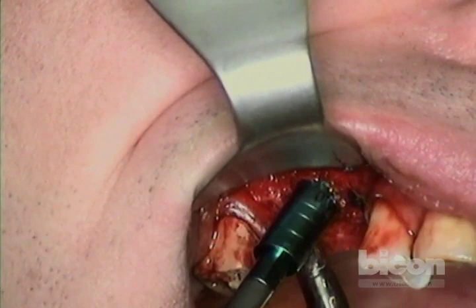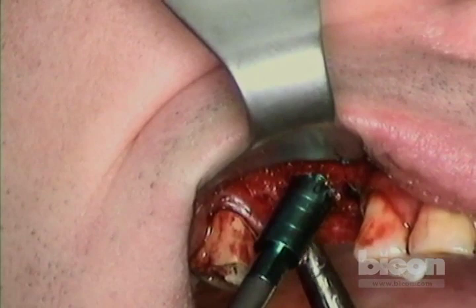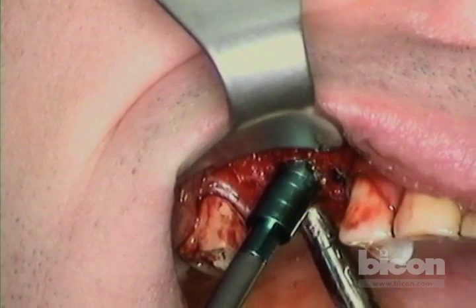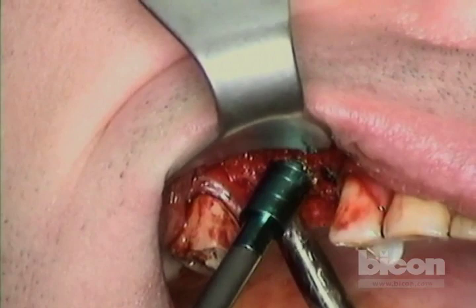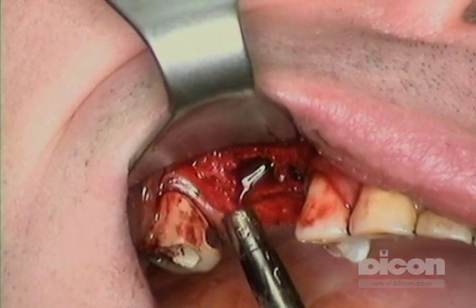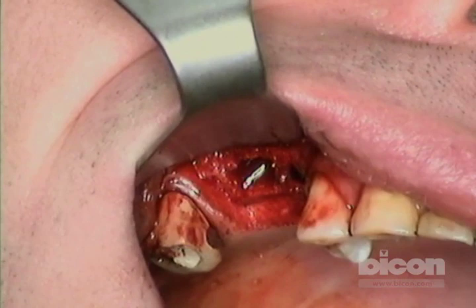The benefit of the floor transport technique is that I move the sinus floor under control with full vision, rather than through a small hole, and I can mobilize it as much as I want. I will still use the sides of the bone to hold the implant. At this point I'm going to add a little bit of bone graft, then use the implant inserter-retriever and finish off with the Bicon sinus lift abutment.